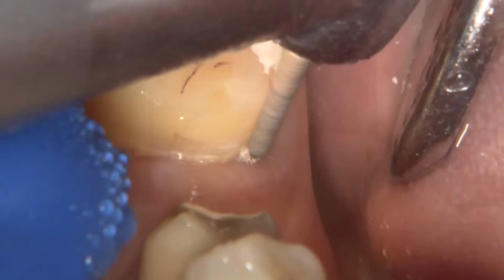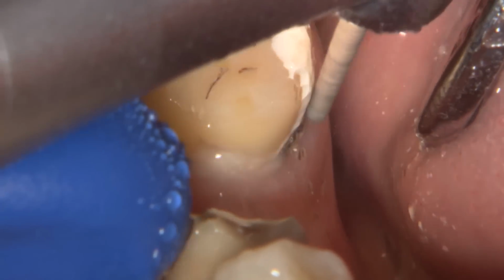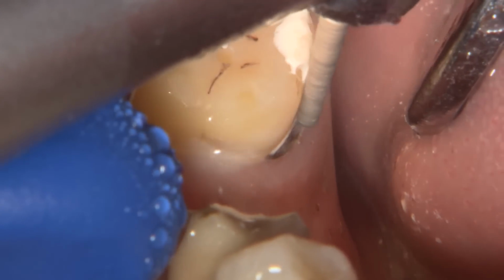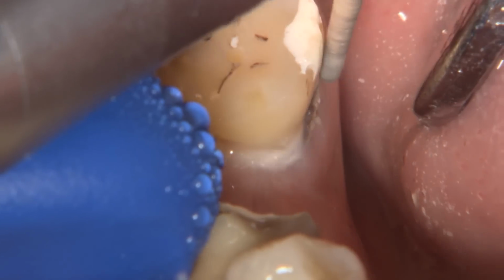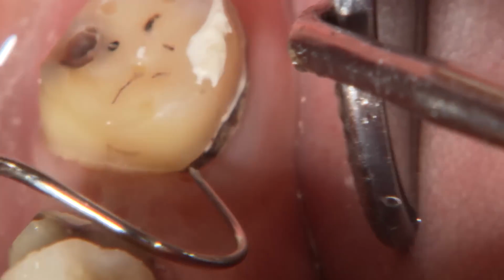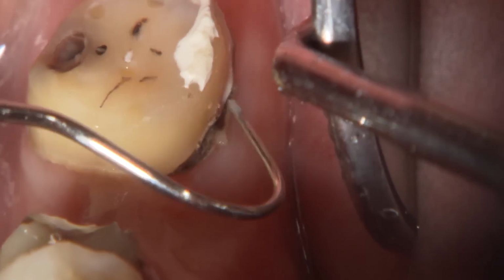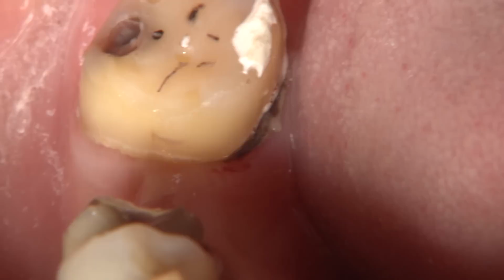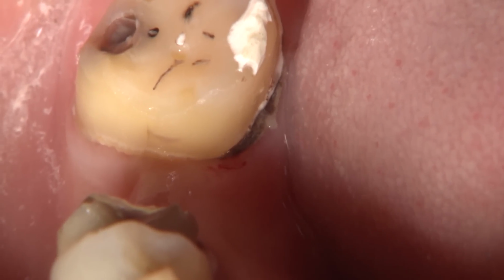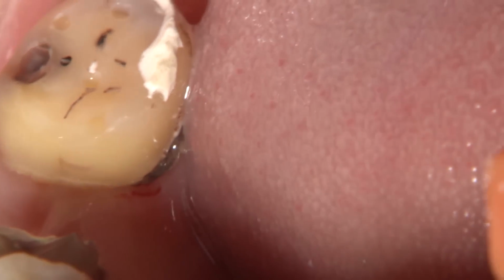This metal bridge had major open areas where the cement washed off, possibly because of a buccal lingual undercut. The poor marginal adaptation created a large amount of cervical caries on the lingual area of the molar. Besides cervical caries, both teeth had secondary caries in close proximity to the pulp. There was a distal caries on number 29 and also one on the buccal of number 31.